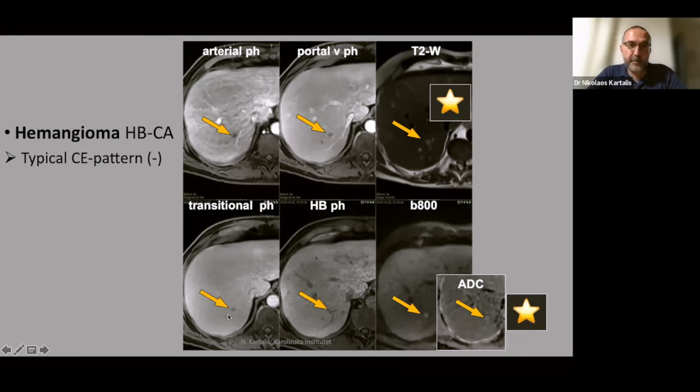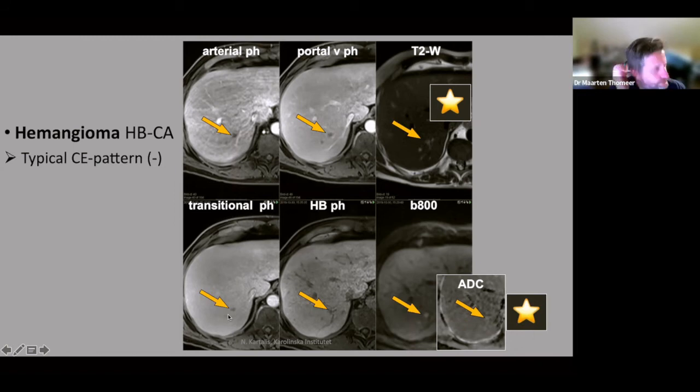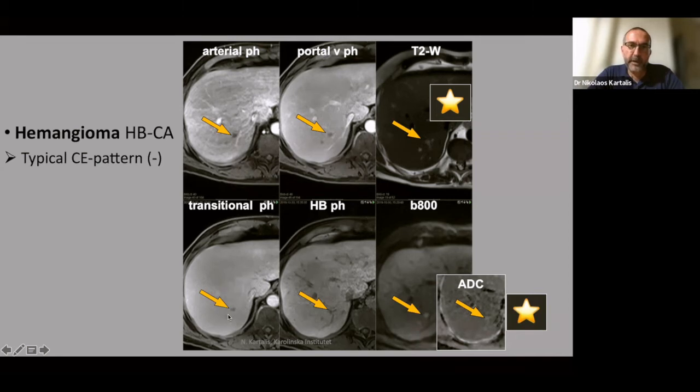I would go for the Primovist because in my practice, we see that the hepatobiliary phase is extremely helpful, and some small lesions are not easily seen on either diffusion or the dynamics. But of course, this is also a matter of local traditions and expertise, because if you feel unsure about how to evaluate the properties of Primovist, then it's better not to use it. It's better to use a contrast agent that you feel comfortable with.